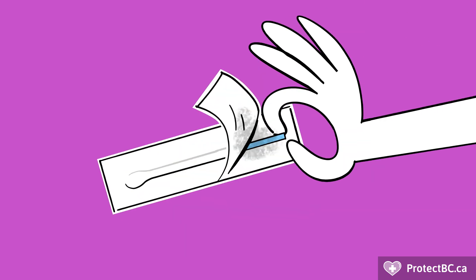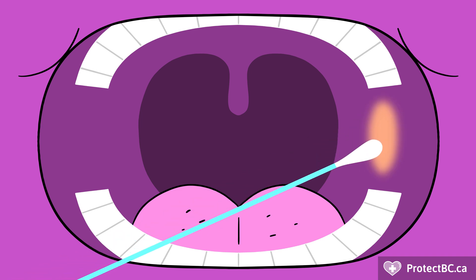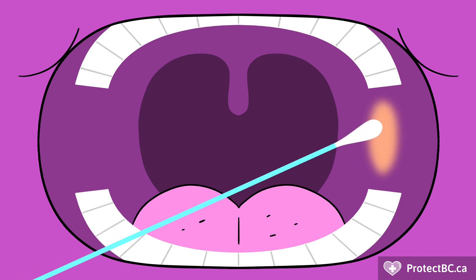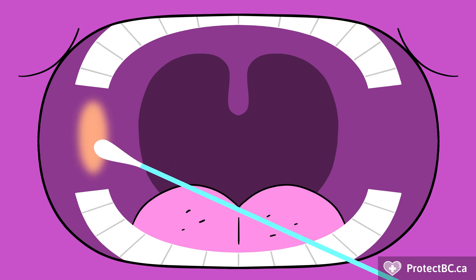Taking oral samples. Remove the swab from the wrapper and grasp the handle. Swab the inside of each cheek between the cheek and gums, rotating the swab for 5 seconds, avoiding your teeth. Make sure to swab both cheeks.